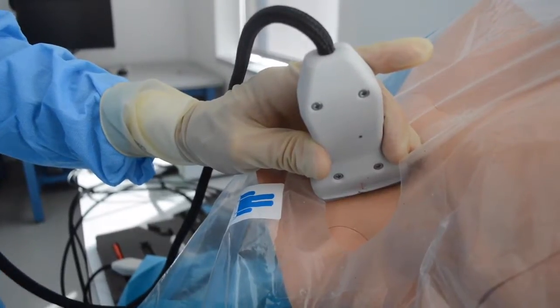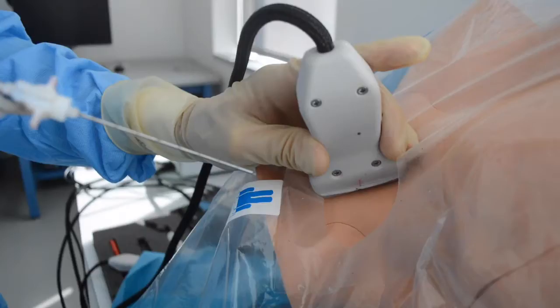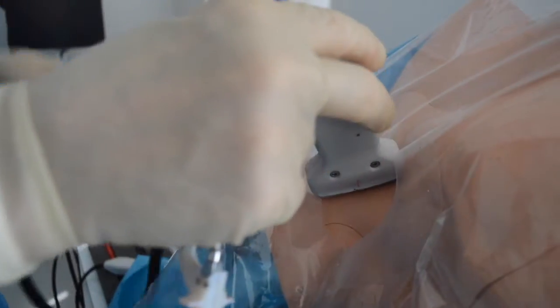When you hold the ultrasound probe, it is easier if you drape the cord over your hand rather than having the cord this way.